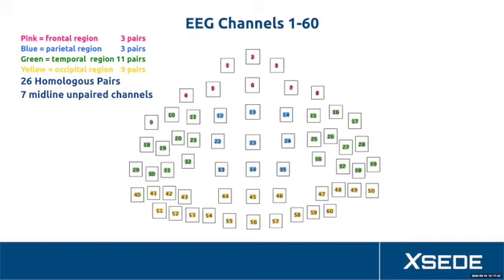That's the EEG. Those signals are more common, of course, and people sleep with EEG electrodes on their head all of the time, but it was added to this instrument to give people 4 different signals to look at. Next slide.